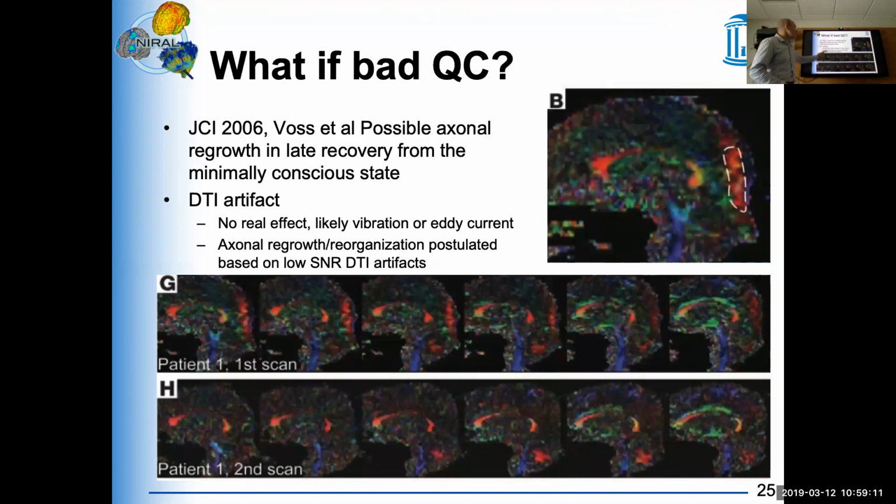We don't see a lot of this anymore, but still, if I see a paper even done on lots of subjects and they're not describing the way their QC is done, I know no QC has been done. And if you are not familiar with diffusion imaging, you just trust FSL, you press that button, and particularly before version 5.1.2, there was simply no QC done.